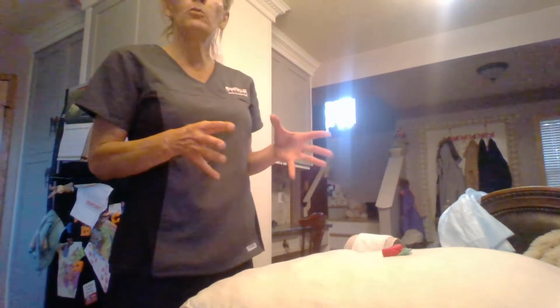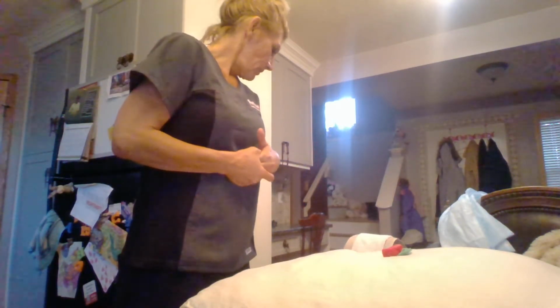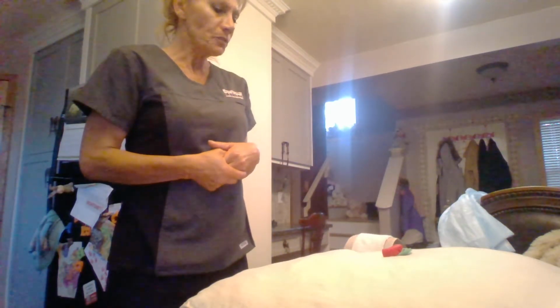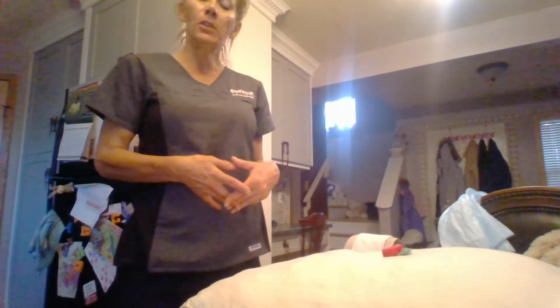You explained to him what procedure you're going to do. You've come to clean and change his stoma today. And he says it's okay, it's good to go. It's a good time for him. You try to change it in the morning.